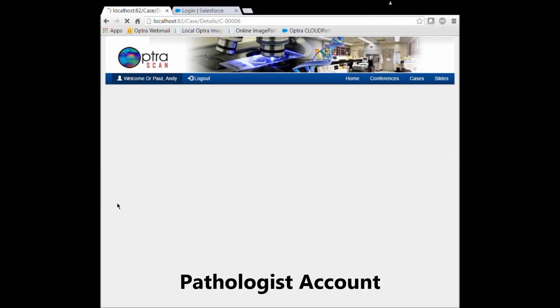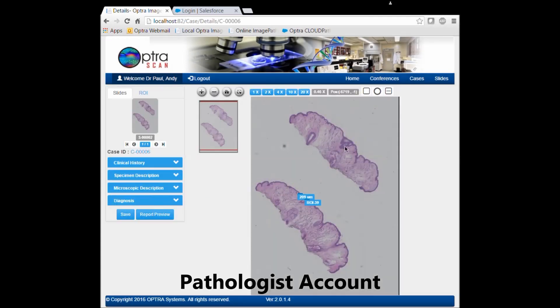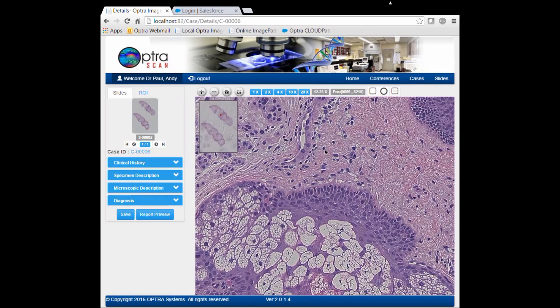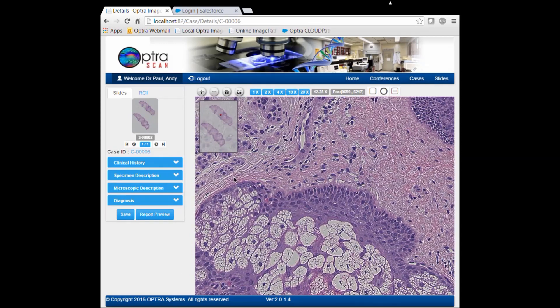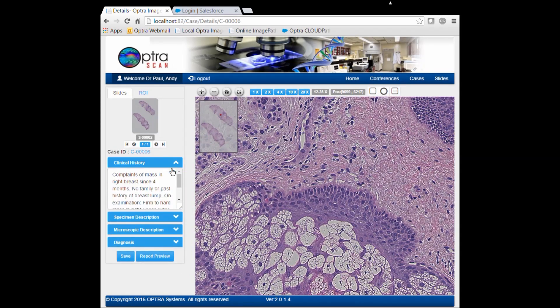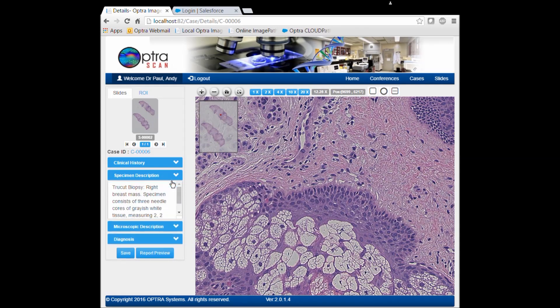The inbuilt web viewer offers numerous tools for the pathologist to make his or her observations, which can be filed on these tabs on the side.